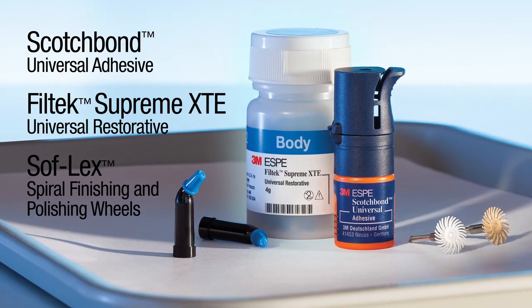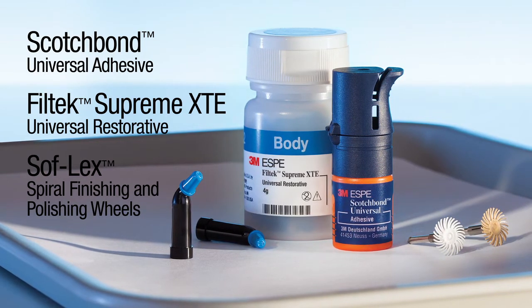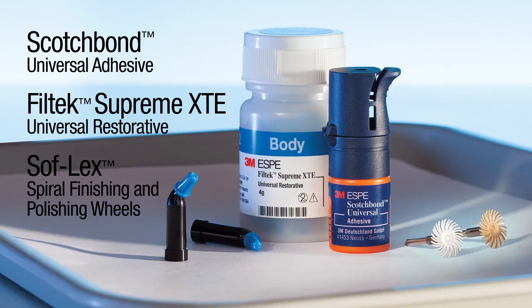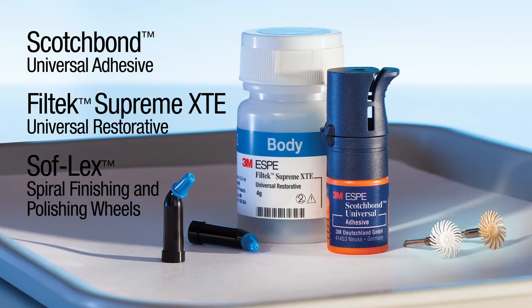Filtek Supreme XTE Restorative provides beautiful, natural-looking aesthetics. Scotch Bond Universal Adhesive provides high bond strength with a one-step application. And Soflex Spiral Wheels polish all tooth surfaces with one spiral shape.